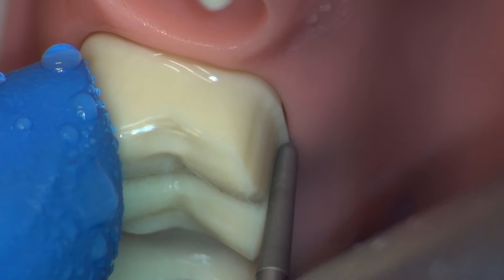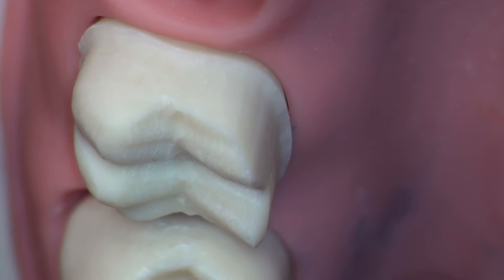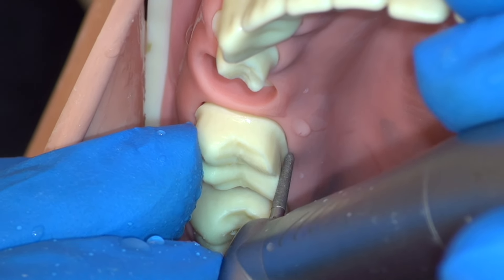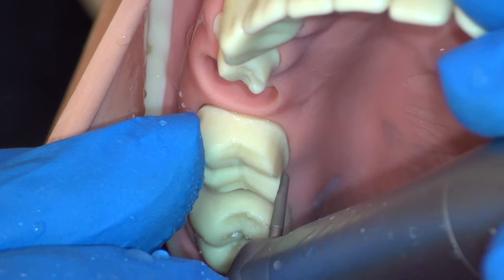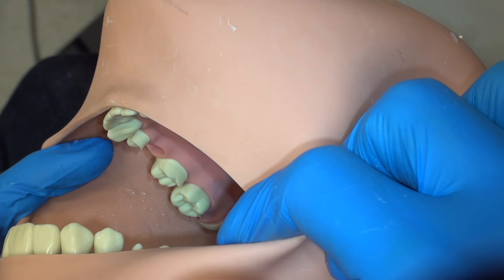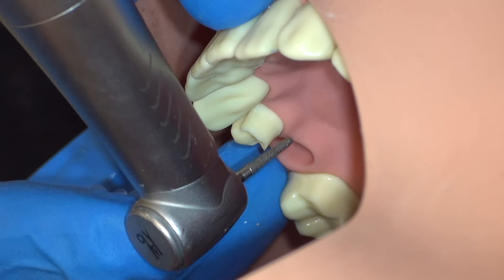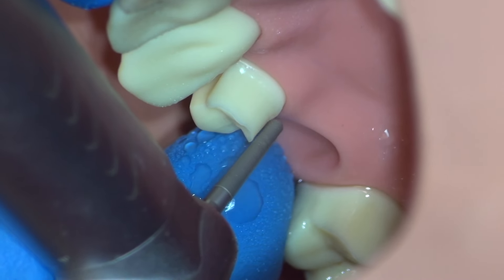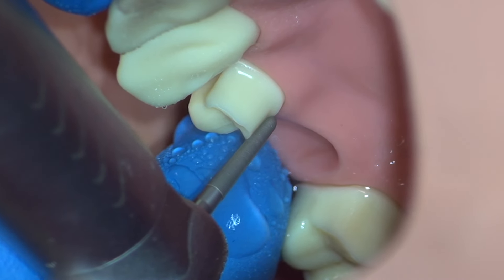Refine the finish line to the final measurement. We want to compare the distal lingual of the molar to our existing linguals, and we find that there is an undercut area already, so we'll go ahead and increase our TOC here and reduce this appropriately. To refine our difficult-to-access distal lingual of the molar, we'll turn the head all the way to the left and visualize it in this way. The handpiece will block your view, so you will have to rotate it to be coming from the anterior of the mouth, and use your left hand to support the handpiece for additional control. With this view and angulation, we can refine the distal lingual of the premolar and the molar in a similar manner.